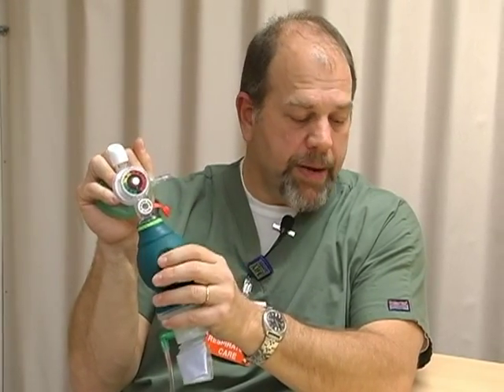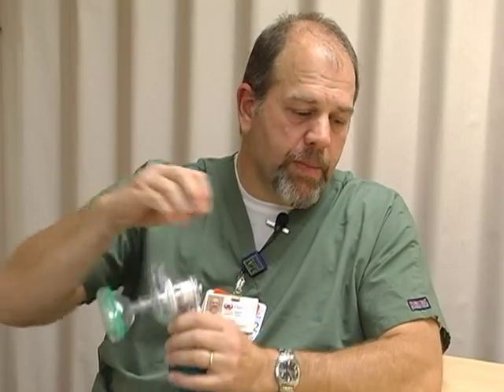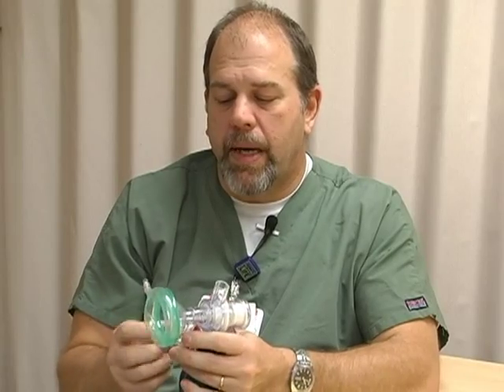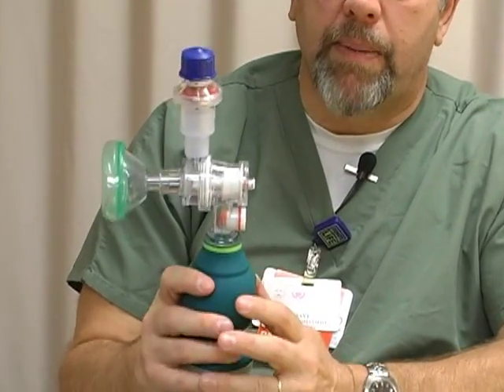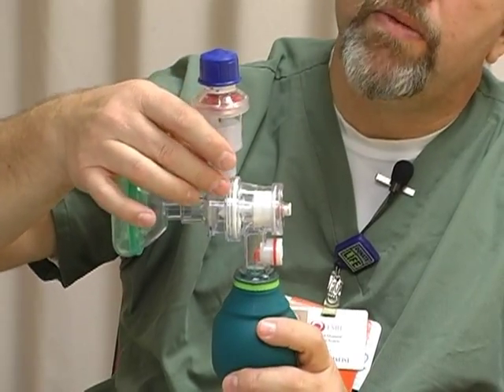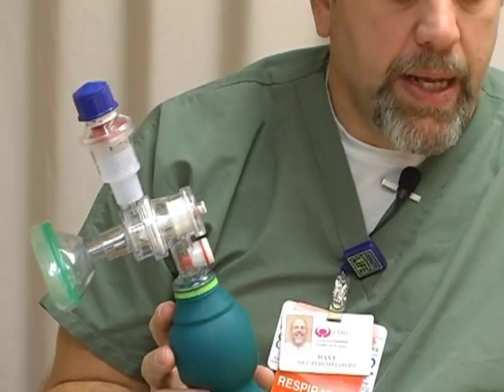Number three: the attachment for the PEEP valve is just a little bit different. With older bags, when you took the PEEP valve out of the package, you discarded the adapter because it fit on with just the valve. With this particular device, you want to keep that piece in one piece because the adapter fits on top of it. So don't throw away the white adapter — it sticks on top of the bag and that's what makes it fit.